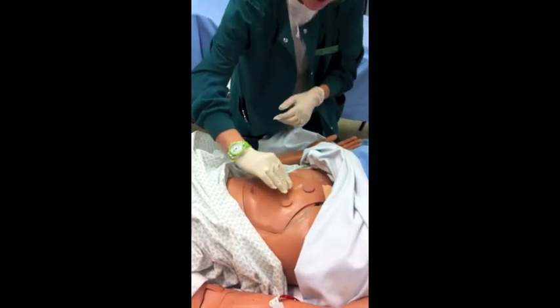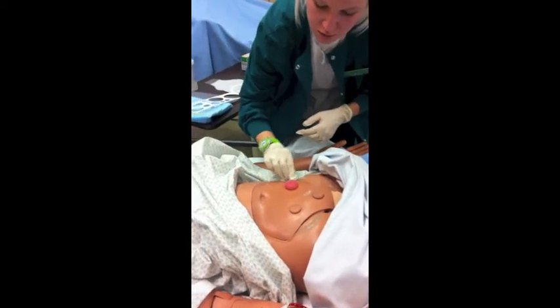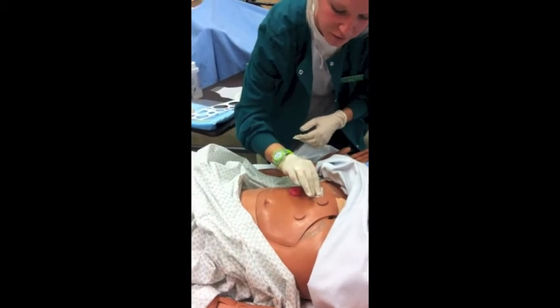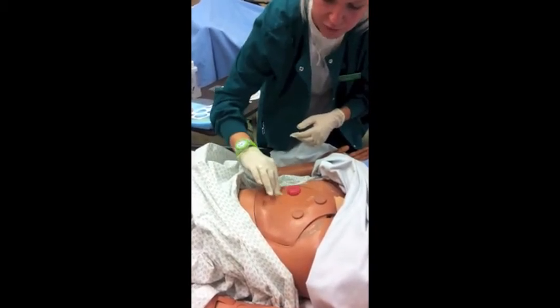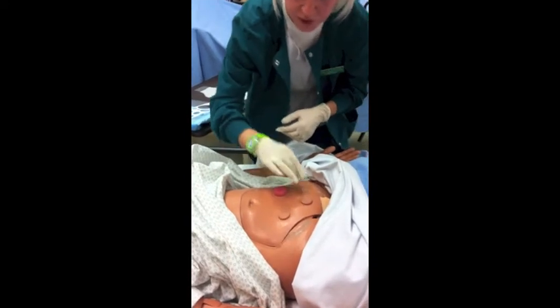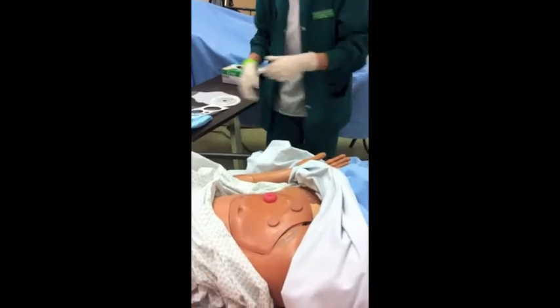I'm going to check for my patient's first and last name. Around, careful not to get the skin prep on the stoma itself, but just the skin around it. It helps the bag adhere more. And while that's drying, I'm going to check the orders.